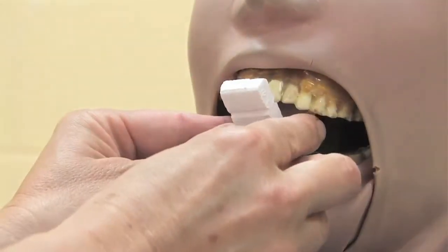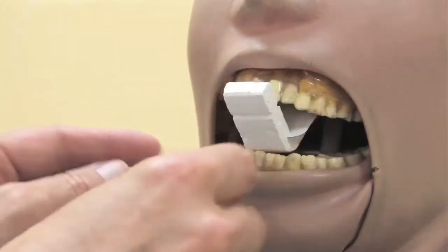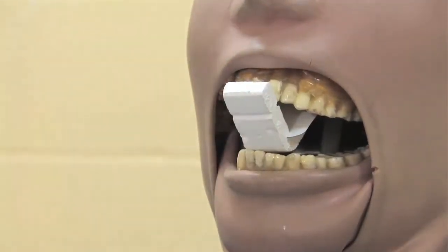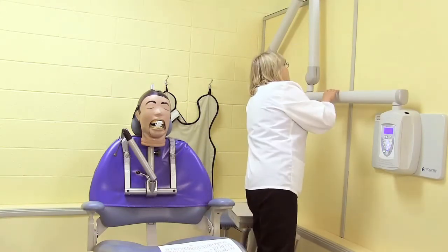Now, my first concern is to ensure that when I place the film, it is not bent in any way. Our client, our Dexter today, has a very shallow palate. But by not bending the film, we decrease the likelihood of distortion in our exposure or our final radiograph.